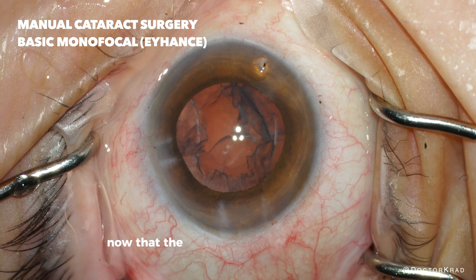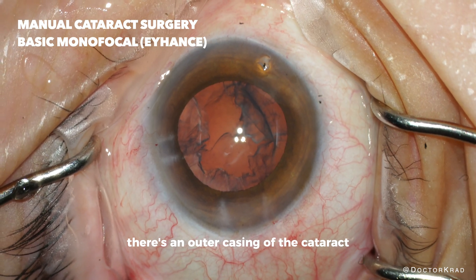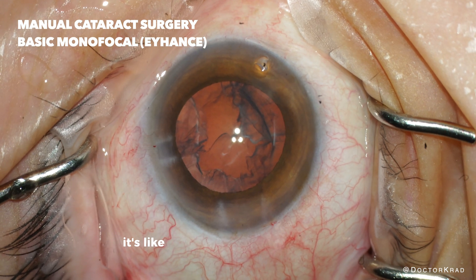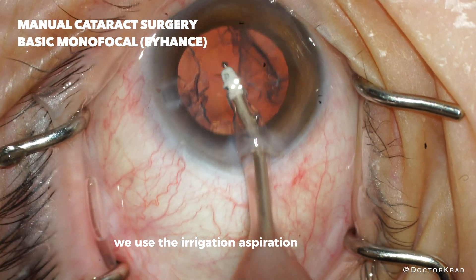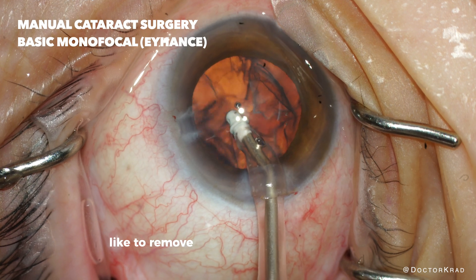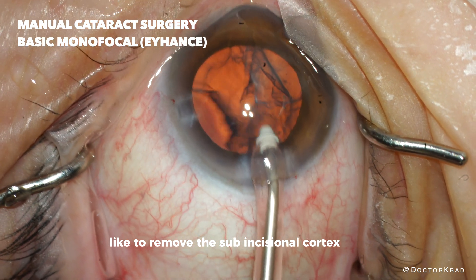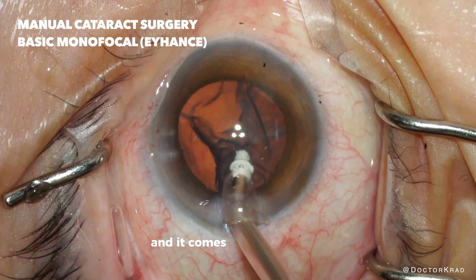Now that the bulk of the cataract is removed, there's an outer casing of the cataract called the cortex — it's like the outermost layer of an onion. We use the irrigation aspiration handpiece to vacuum it out. I typically like to remove the sub-incisional cortex first, so I'm just doing that right here and it comes out pretty easily.